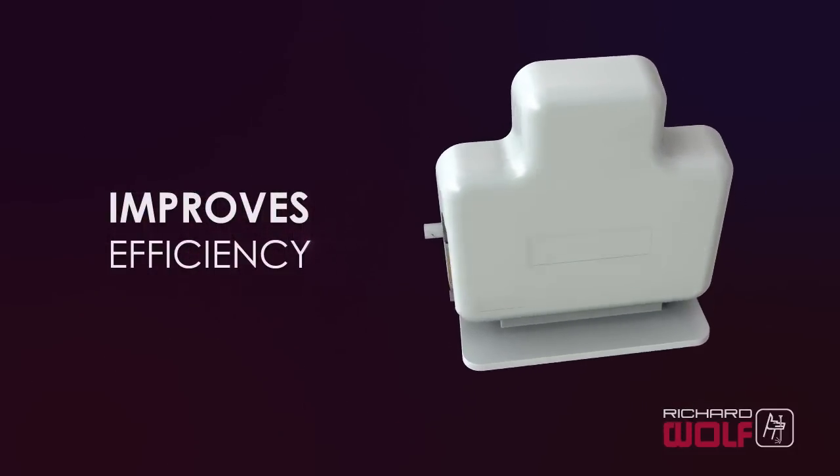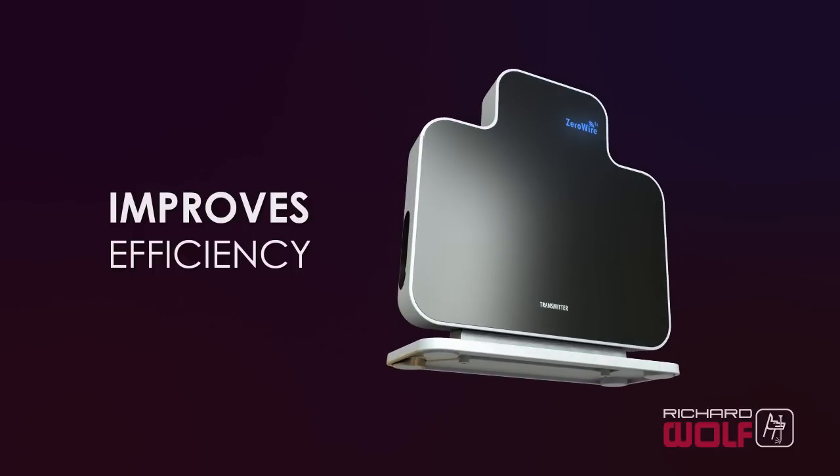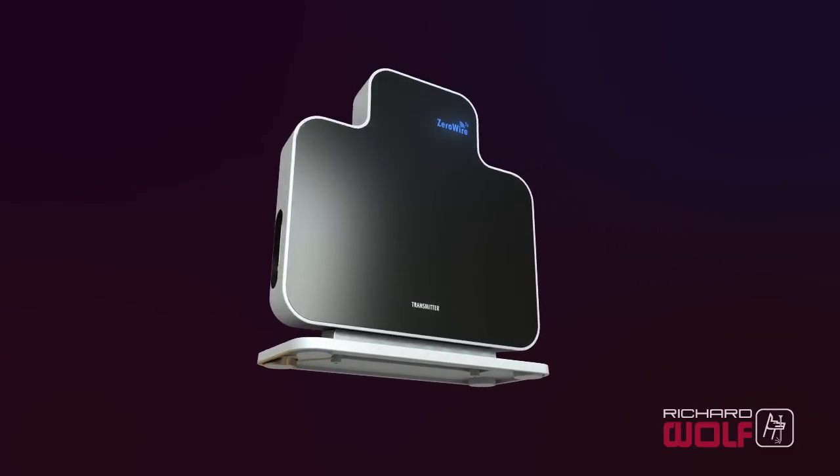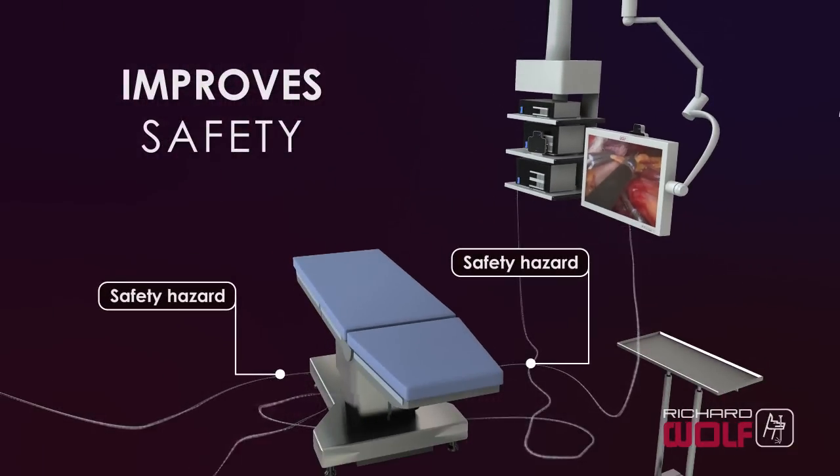ZeroWire improves efficiency with faster turnaround times by reducing downtime from wires getting disconnected and shorter cleaning time between procedures. ZeroWire improves safety by eliminating hazards during procedures such as cables on the floor.